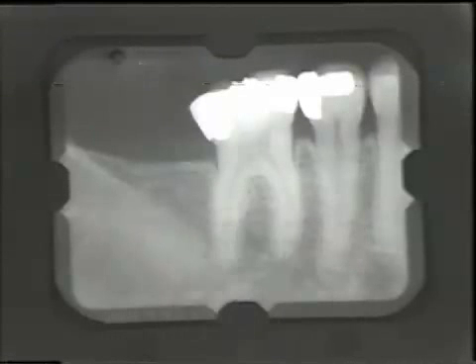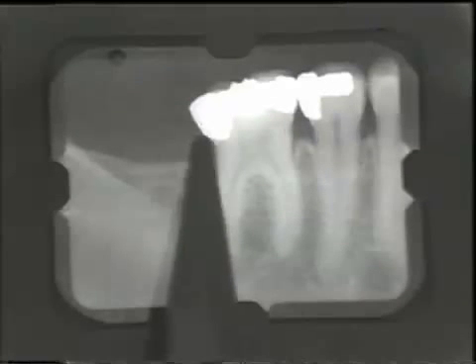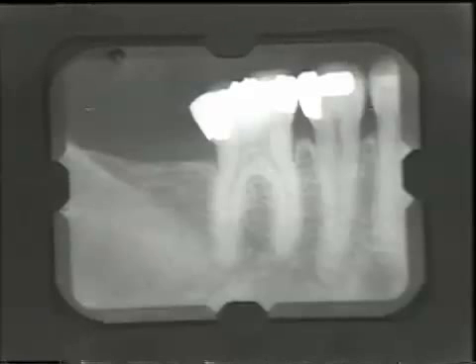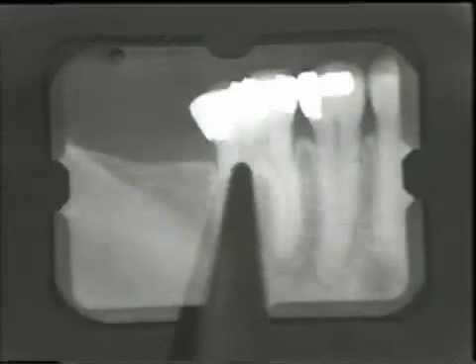We also look at the morphology of the root, and in this case this first molar seems to have a nice blunted root tip — it is not diminutive by any means. There has been some minor loss of periodontal support, and there appears to be no recurrent decay. The amalgam restoration present does have a minor imperfection at the distal margin, but this will probably be altered during the preparation of the abutment teeth.